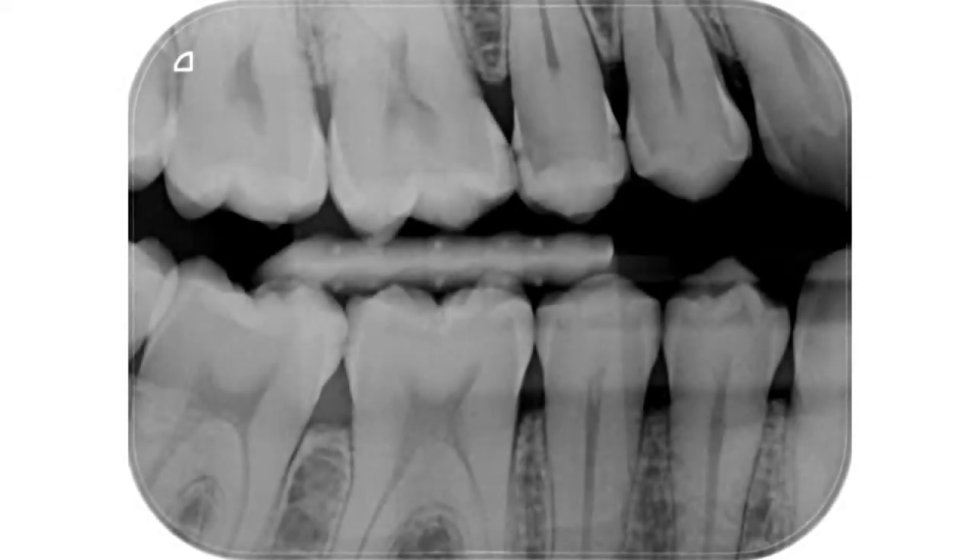This is a 38-year-old man reporting slight sensitivity to cold stimuli. A bite-wing radiograph reveals several interproximal caries lesions. The maxillary second premolar shows a large distal caries and a minor mesial caries lesion. The cold sensitivity test gives a slightly exaggerated response for this tooth. The diagnosis of reversible pulp inflammation is made.